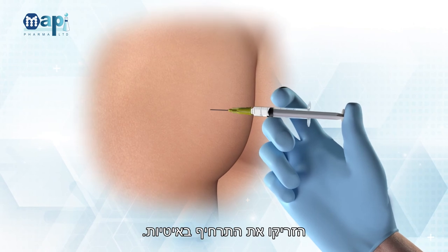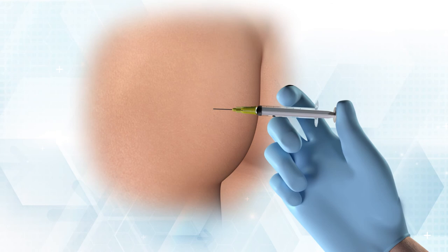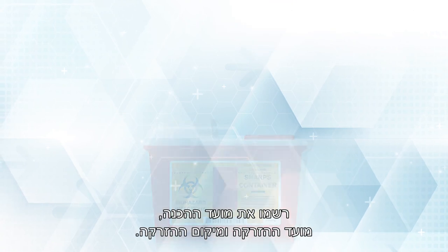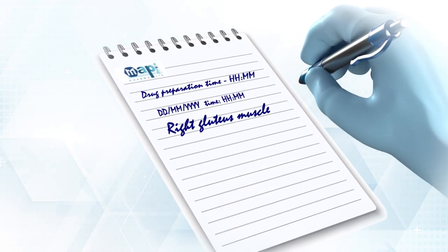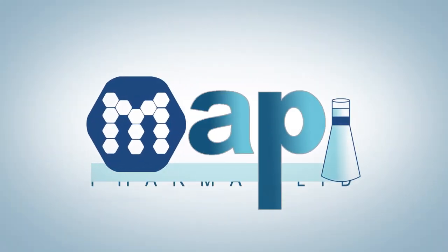Inject the suspension slowly. Following injection, discard the needle and syringe into a biohazard bin. Document injection preparation time, injection time, and injection location. MAPI Pharma.